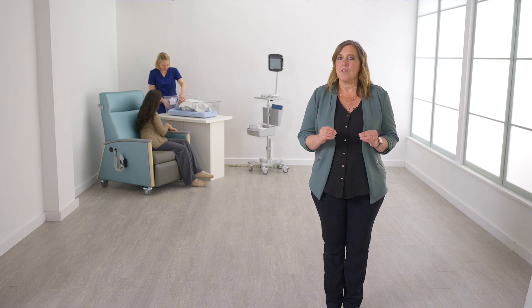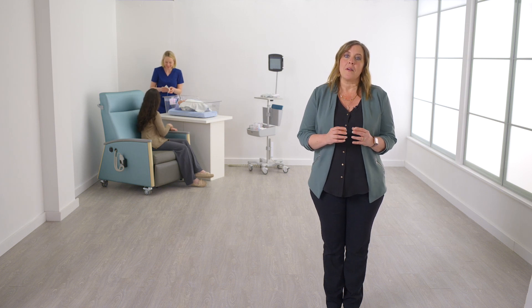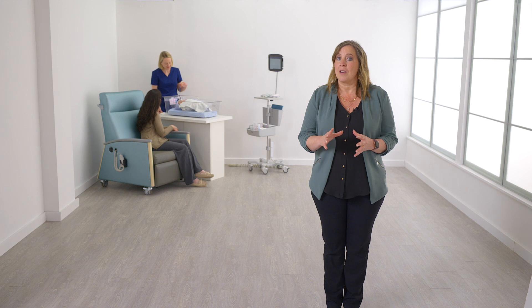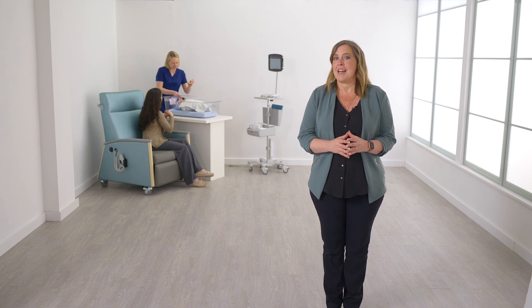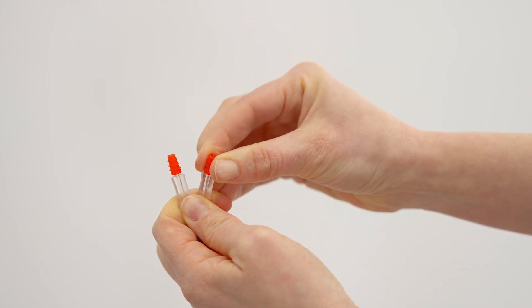If you are using insert phones with ear tips, inspect the baby's ear canal opening and select the appropriate size ear tip. The red phalanged ear tip fits most newborn ears. However, you may have to select a different size tip based on your inspection of the ear canal. Place the ear tip on the clear adapter at the ends of the red and blue tubing.